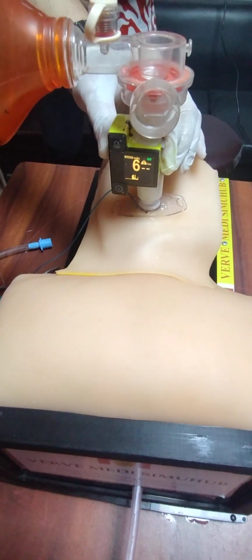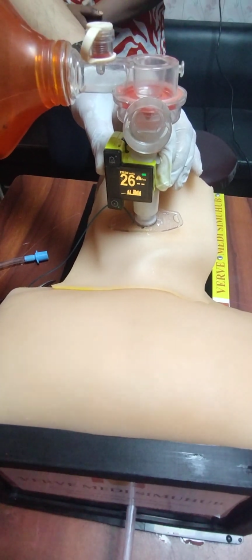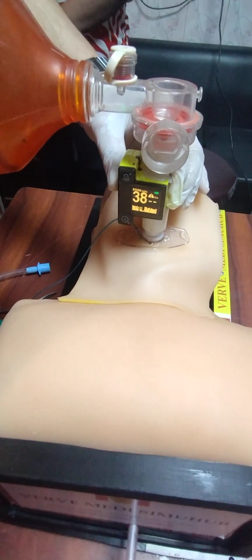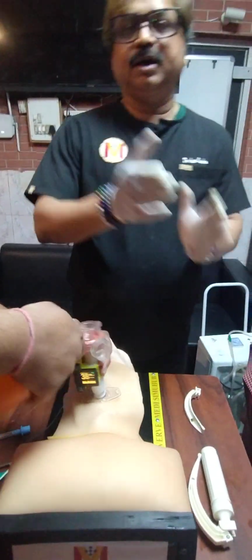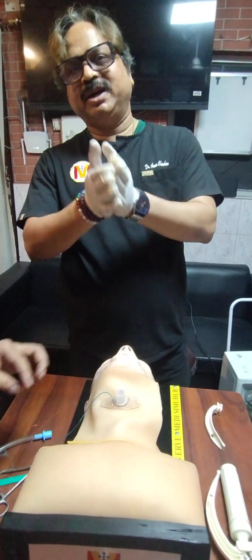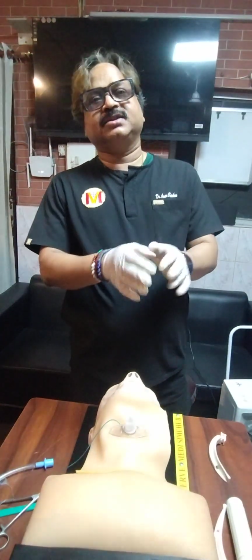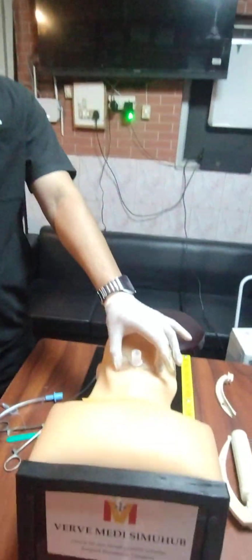So, yes, 36, 32. So we are in the right place. So tracheostomy, surgical cric we have done, and that is in the right place. So these are the two scenarios we practiced today. One is difficult intubation, and definitely this straight blade VL laryngoscope is going to help you in such circumstances. And secondly, when it is a failed intubation, then in the same mannequin you can do a surgical cric.